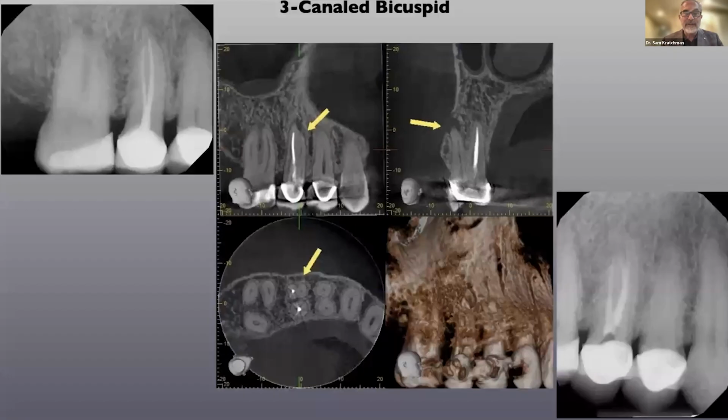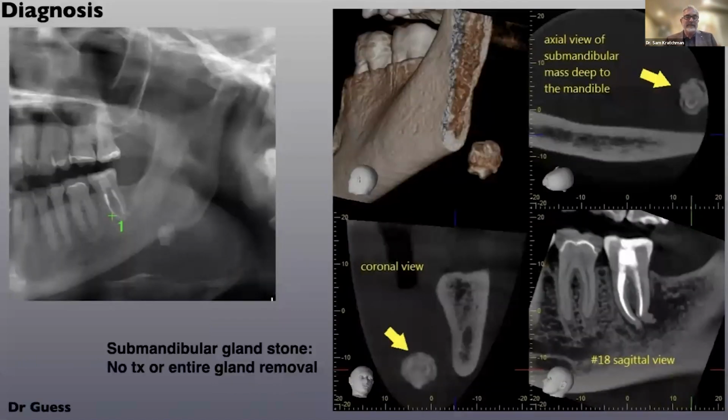So I'm going to skip over this. I've shown that before. And here's a crazy one. Patient comes in, and this is my former resident, Garrett, out in San Diego, who takes this crazy-looking cone beam, and it looks like something is floating out in space. Sends this to an oral surgeon, the cone beam slices and the slice from the Panorex.